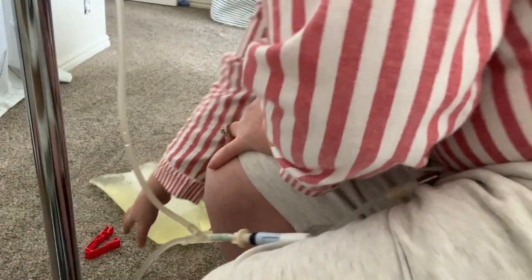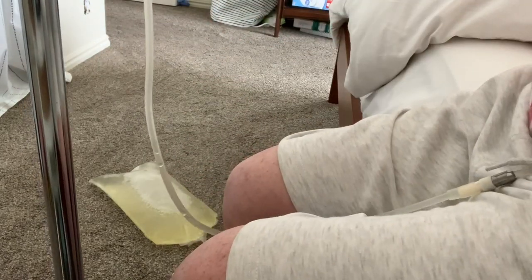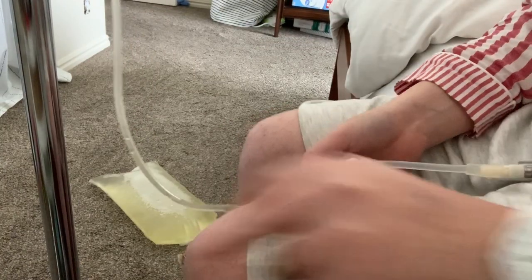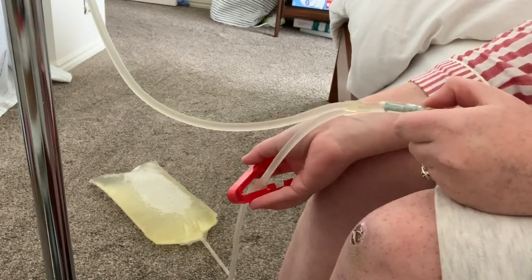I dropped my waste bag on the ground again. Now I'm going to drain this back — well not back — I'm going to fill the new solution into me. I'm gonna try my hardest to show you guys this next part. I'm gonna clamp this bag off and break the seal, and then my transfer set is closed. I'm gonna open the clamp on the top one.